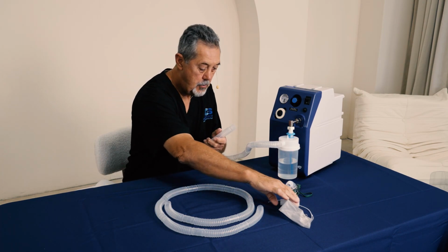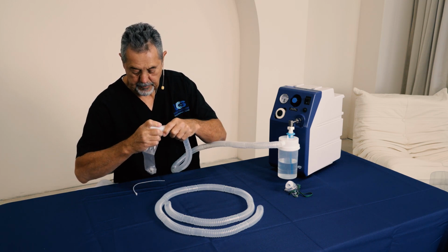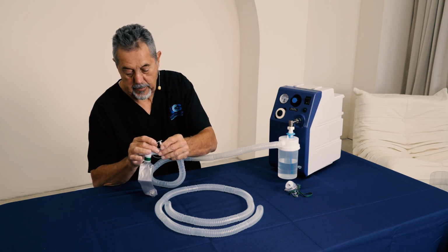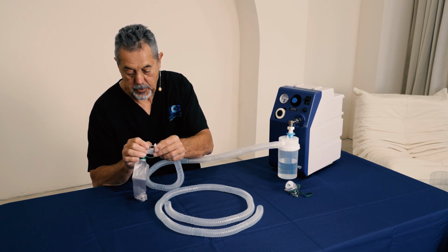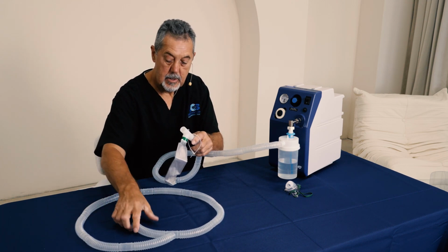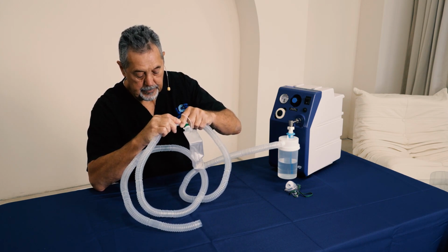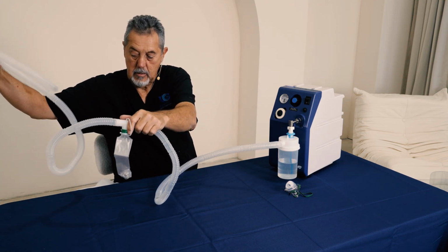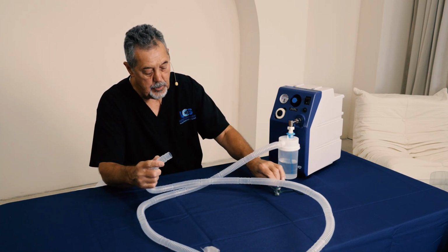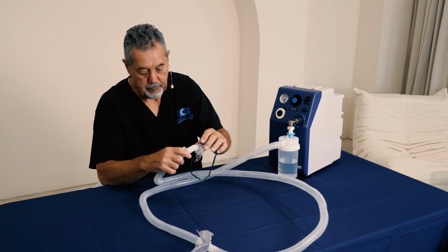The other side of the tubing will go to your drain bag. This is in case you want to secure it to, let's say, the rail on the side of the bed, which you can. Okay. On the other side, you're going to want to put the rest of your corrugated tubing. And on the other side of your corrugated tubing, you're going to want to put your tracheostomy mask, your trach mask.